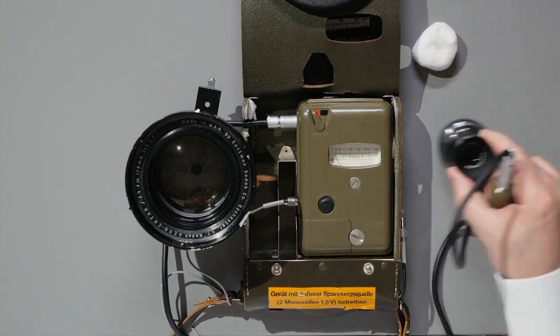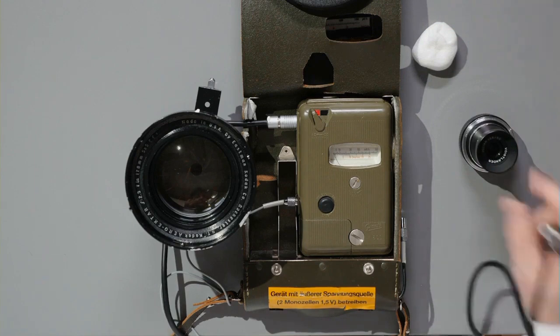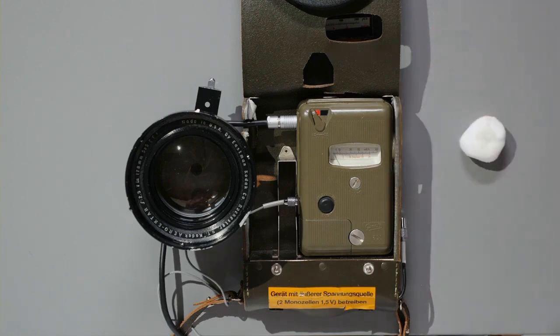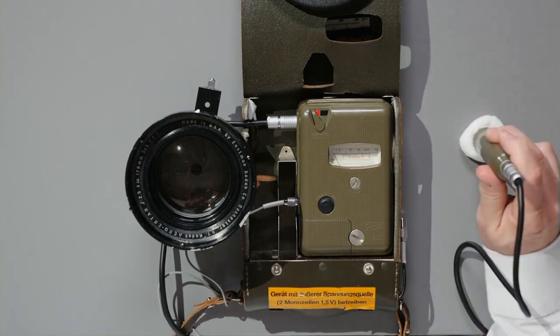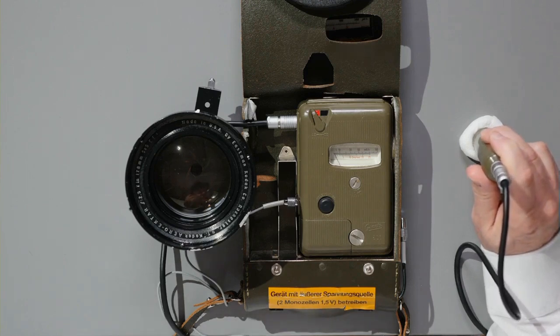And today's modern lens practically has none. It doesn't seem to emit any radiation at all. Look, I'm moving this lens away a bit. Here's the swab itself. Oh, something is starting to move.